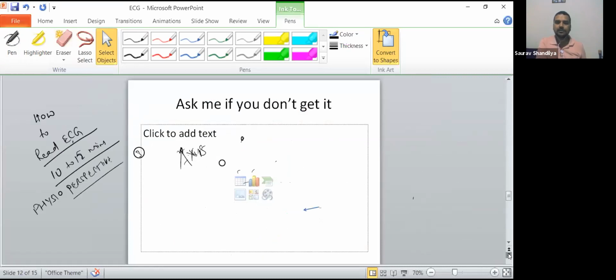Okay, so I was talking about axis. Forget about axis now. We'll not talk about axis anymore. Okay, axis is okay. That image, if you keep it in mind, if you want, I'll send you that image also. Now, the next characteristic for physios, the next thing a physio should know about learning ECG. If you know axis, always good, but you should know the characteristics of the P wave, which you just learned.